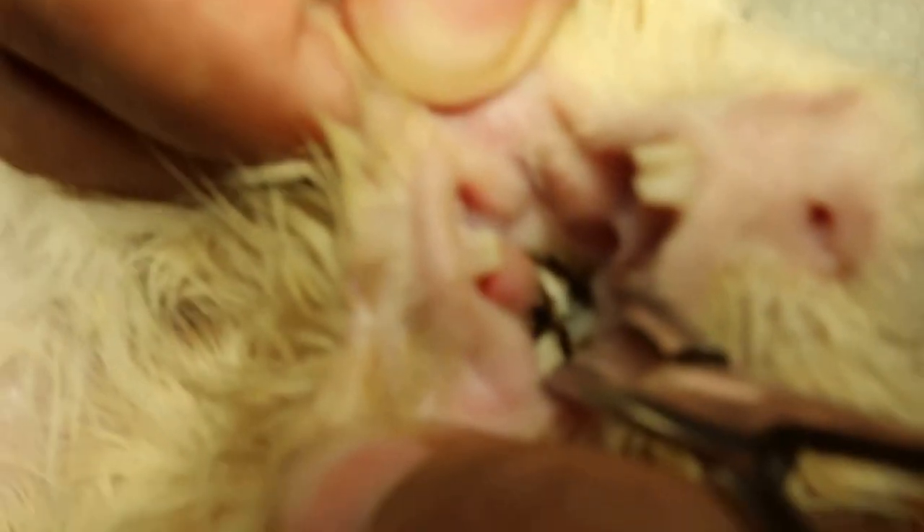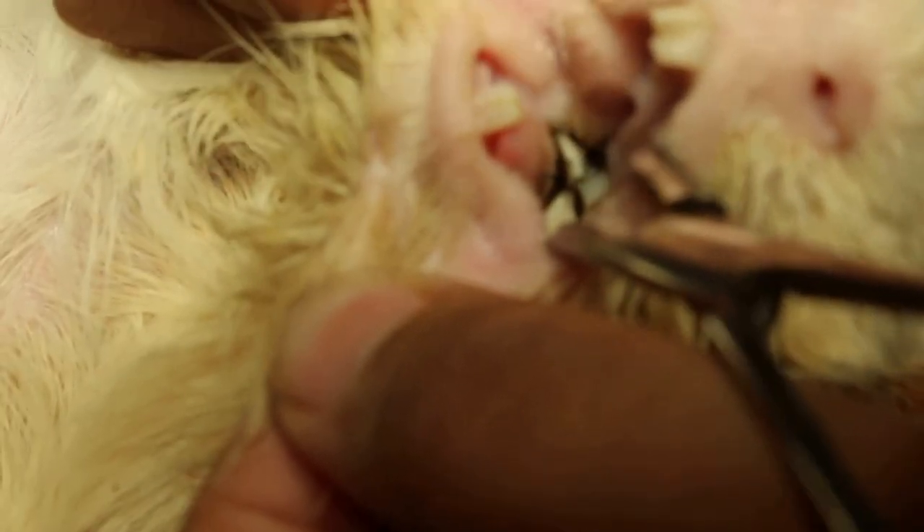Right lower molar. And I need to clip it short, otherwise it'd be hard for the guinea pig to grind.